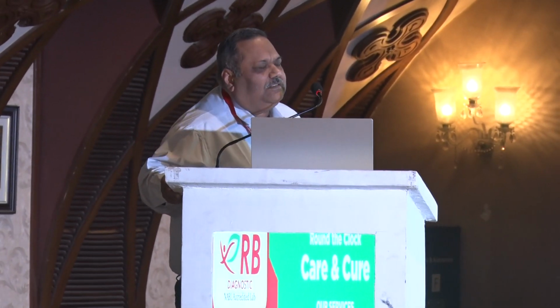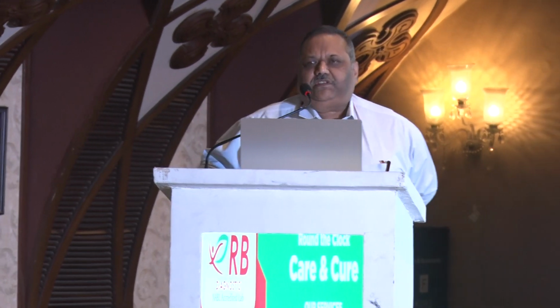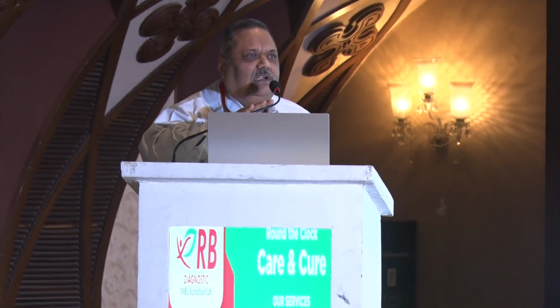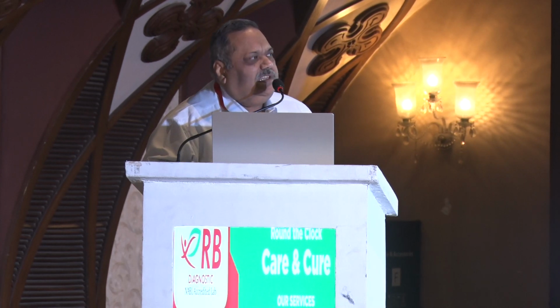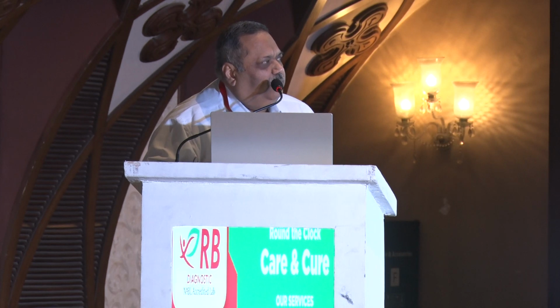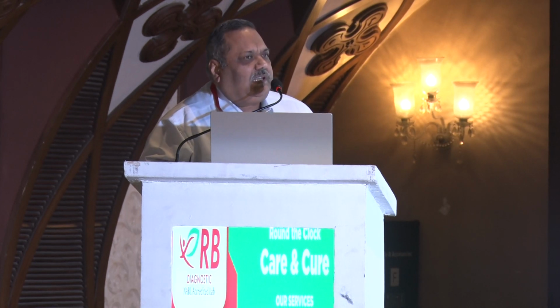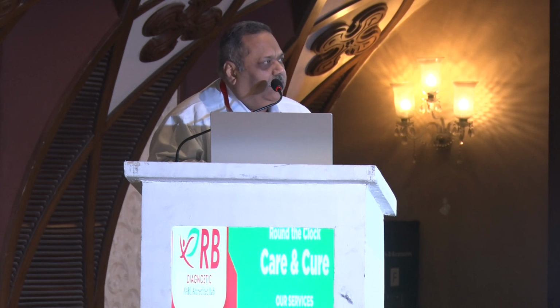See, that's an excellent question, because everybody may not have immunofluorescence. But let me tell you that immunofluorescence is mandatory for a renal biopsy, because if IgA is there, it may give you a PAS positivity. But that can come in SLE also, that can come in so many other things. You may not be able to pinpoint that it's IgA.